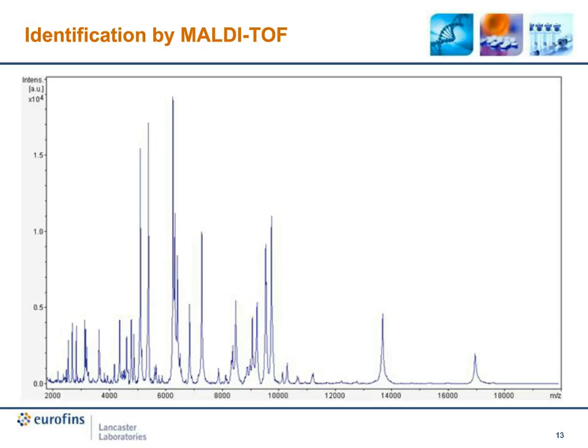I'd like to note that while numerous peaks in a spectrum like this are obvious to the user, we can see very clearly where they are. The system software typically identifies 90 or more significant peaks for evaluation. This is an important point to keep in mind as we discuss the organism identification process.